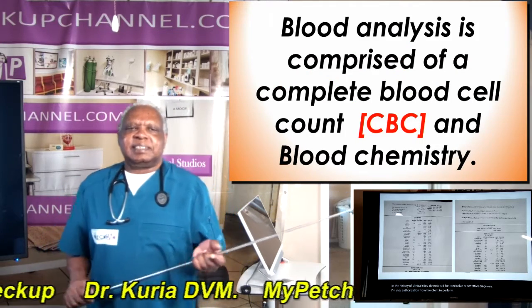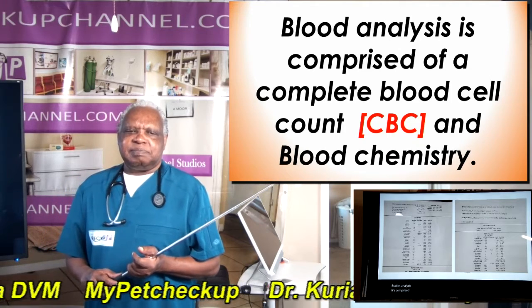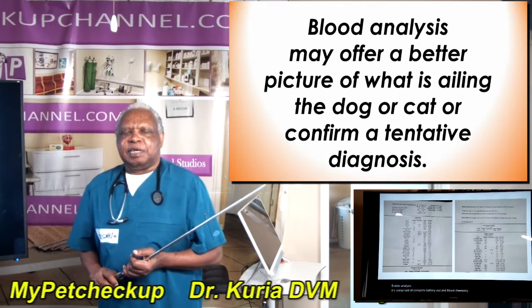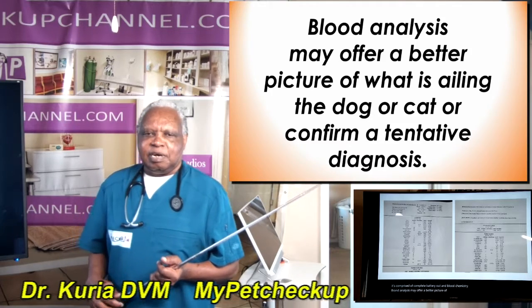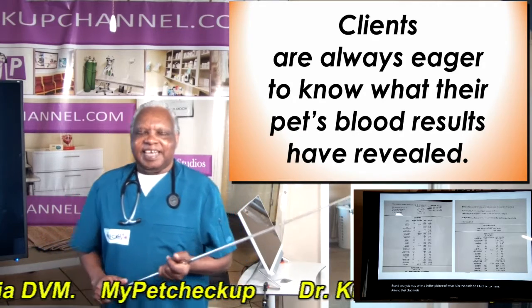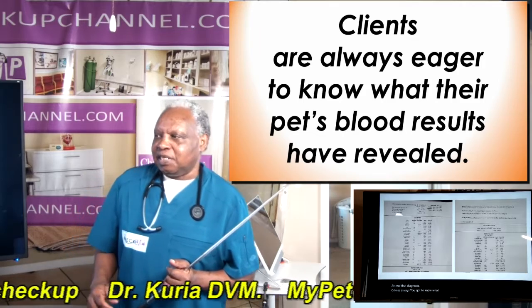Blood analysis is comprised of complete blood cell count and blood chemistry. Blood analysis may offer a better picture of what is ailing the dog or cat, or confirm a tentative diagnosis. Clients are always eager to know what their pet's blood results have revealed.